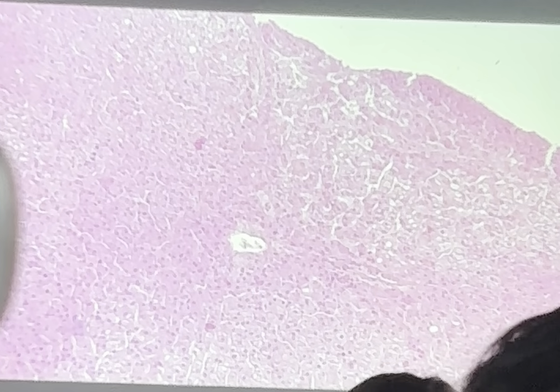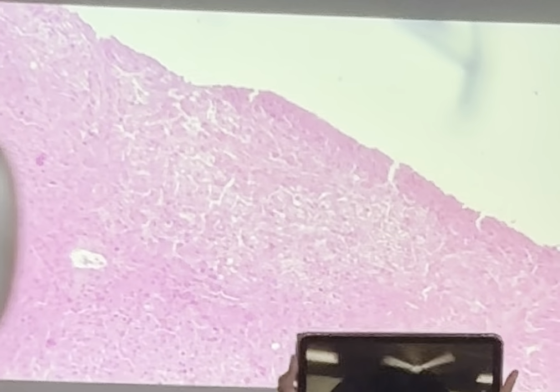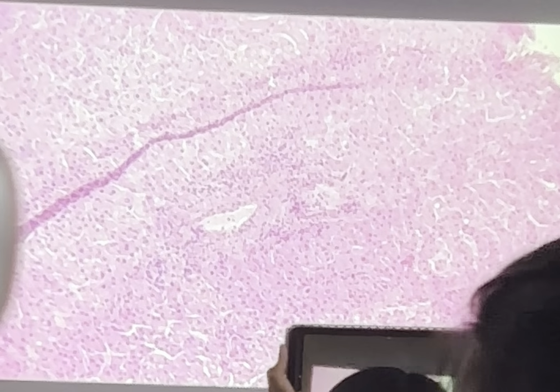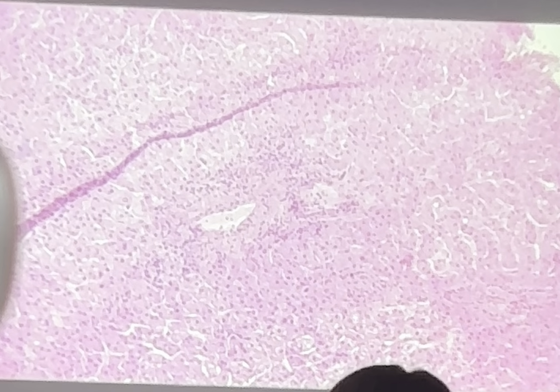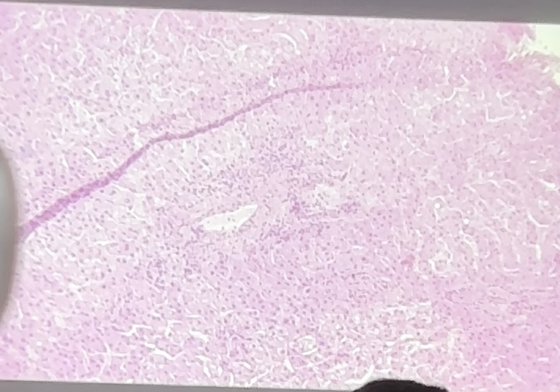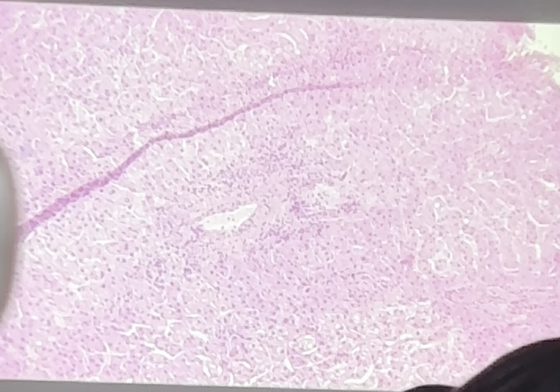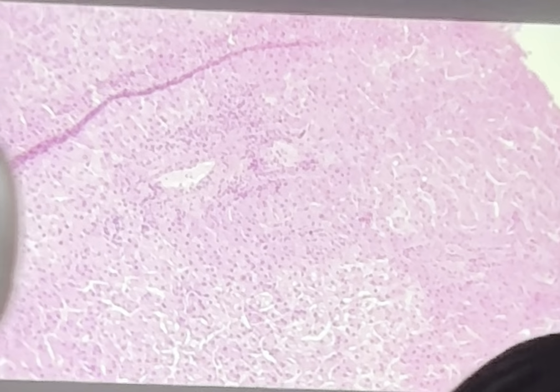Actually, it's not normal because there are a few things I want to point out. So this is the liver. Okay, good job. And you remember your histo. Let's look a little bit into the liver. There's a better area. Okay, so first off, we see some inflammation. So we see a lot of little mononuclear cells. The mononuclear cells are the cells that you usually see in chronic infections, as opposed to acute infection. What's usually the predominant cell in acute infection? Neutrophils. Don't worry, you'll learn about that tomorrow. So we see some chronic inflammation.